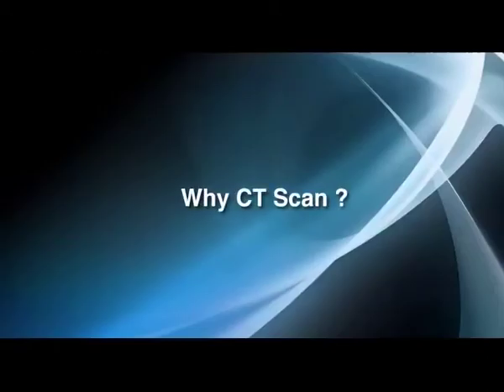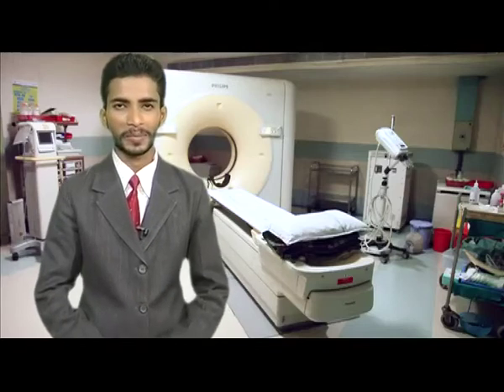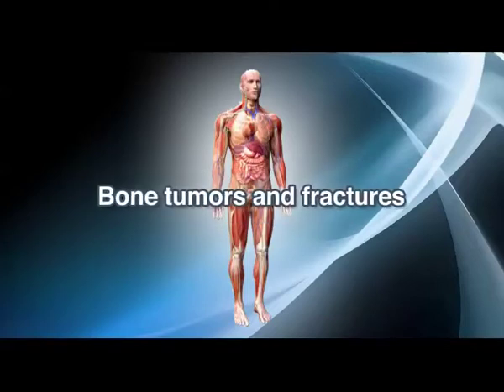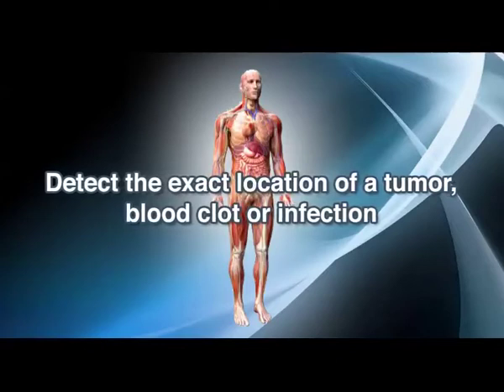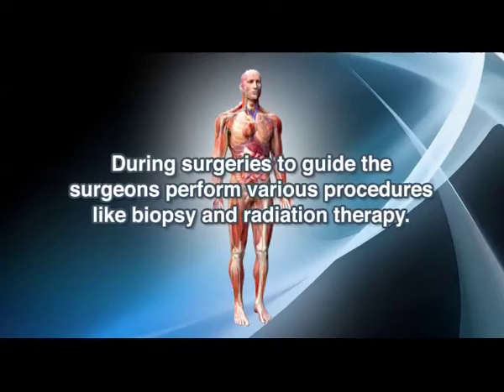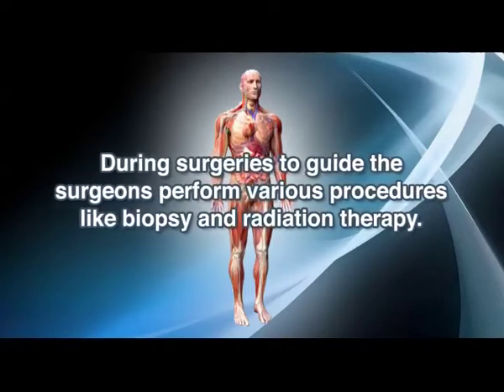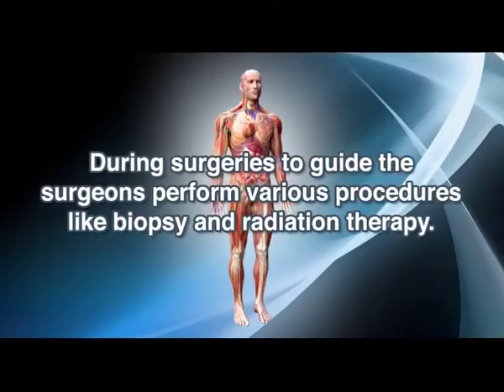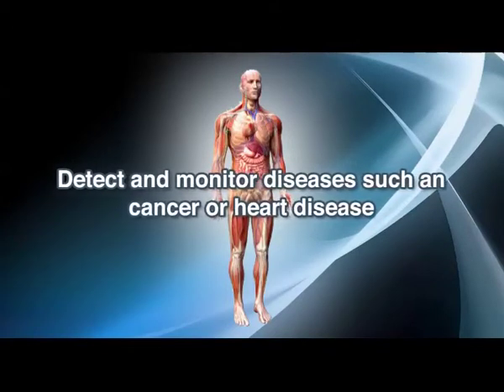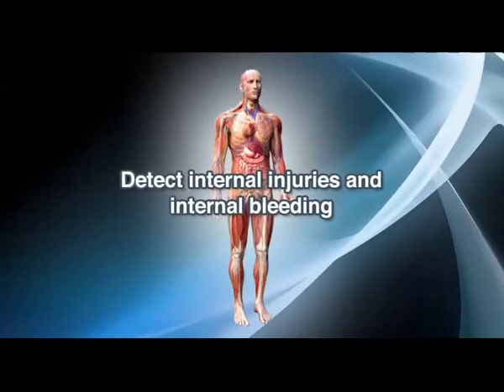Why CT? You have seen what a CT is, a computerized tomography. But why is it done? What is the necessity? Let us see what exactly are the reasons behind CT. To diagnose muscle and bone disorders, bone tumors and fractures, detect the exact location of a tumor, blood clot or any infection. During surgeries, to guide the surgeons perform various procedures like biopsy and radiation therapy. Detect and monitor diseases such as cancer or heart disease. Detect internal injuries and internal bleeding.